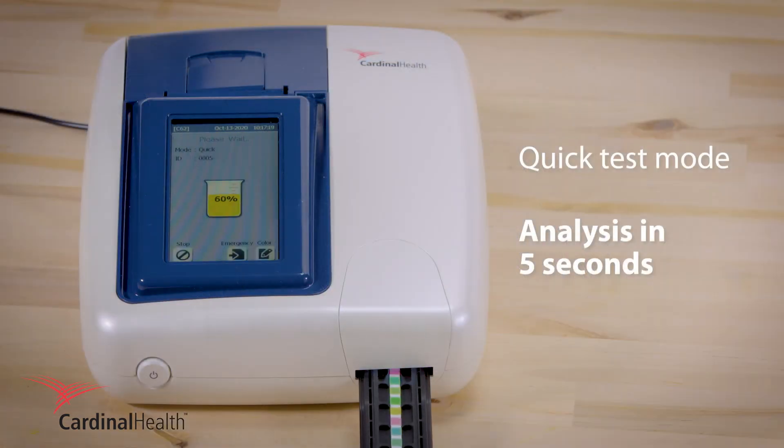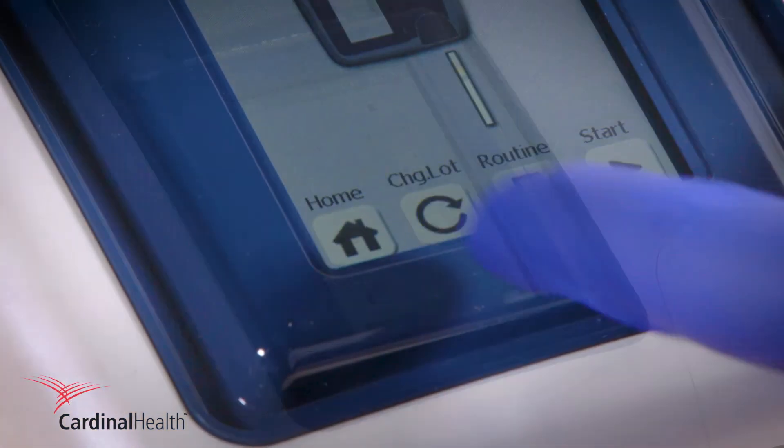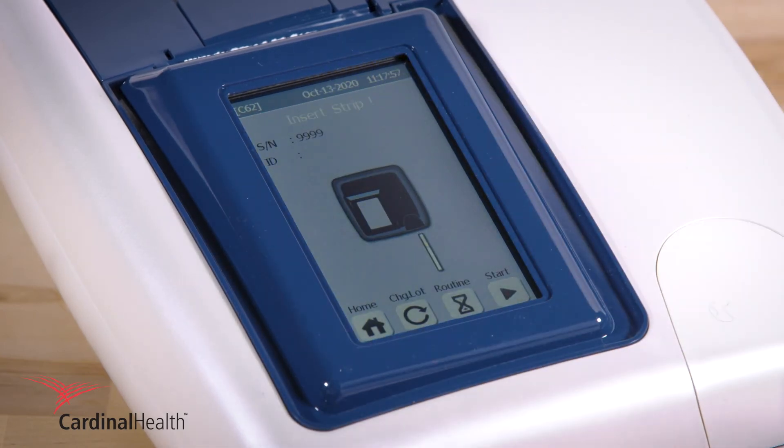For faster results, use quick test mode. Tap stop on the touch screen, press measure, then routine. The icon will change to a lightning bolt for quick test mode.